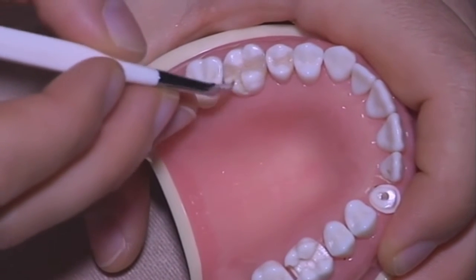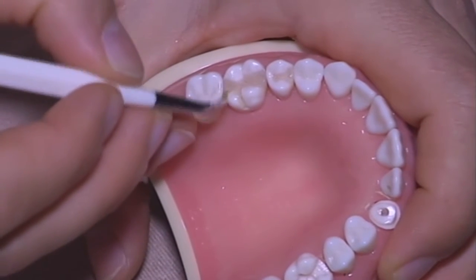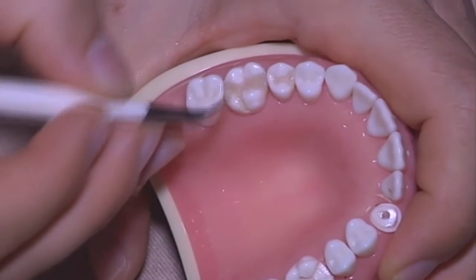As you can see, the most useful tool for posterior, but in general for composite layering, is this one.